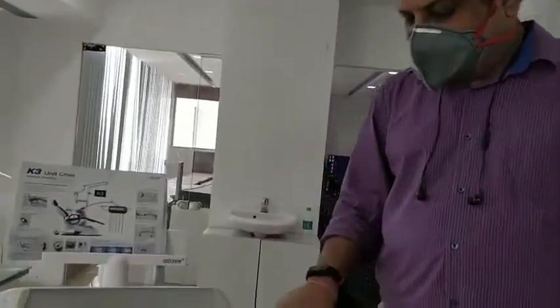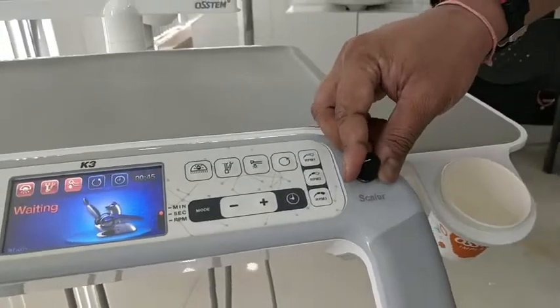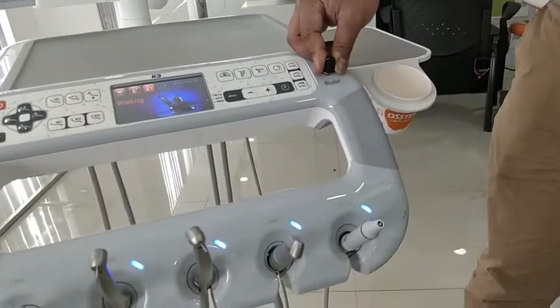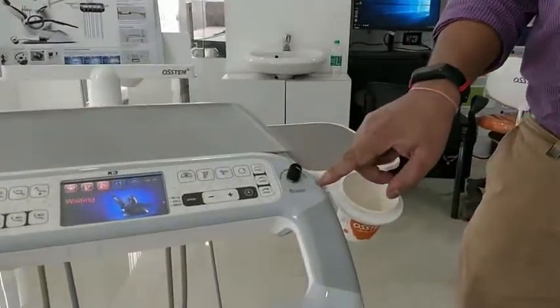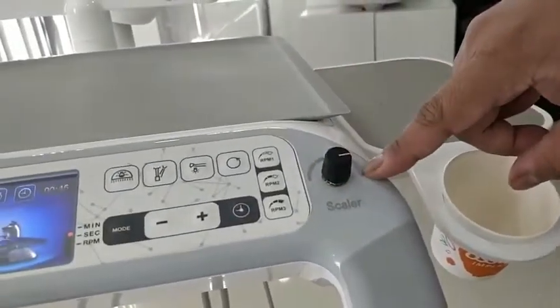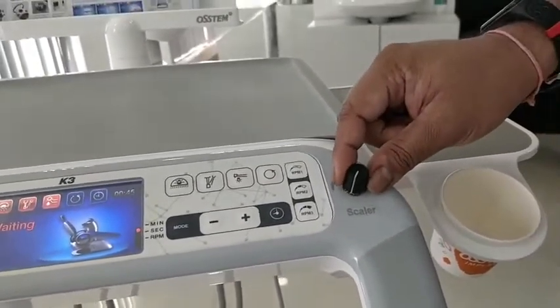The knob here is the scaler button, which controls the vibration of the ultrasonic scaler tips. For a patient with very hard, calcified calculus, you can use a higher mode. For anterior or lighter calculus, you can use a lower mode.